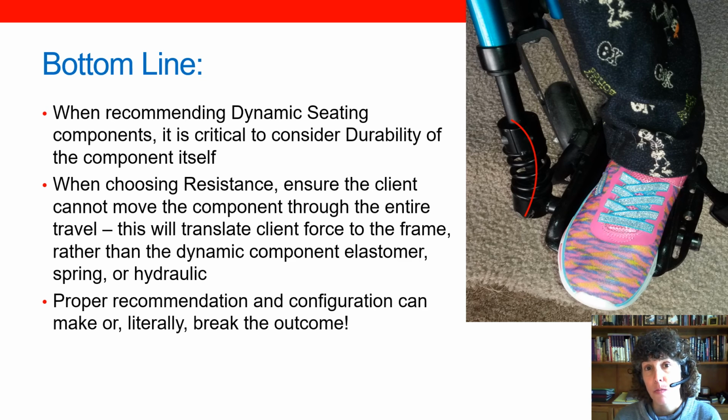Bottom line, when we're recommending a dynamic seating component, it's important to keep in mind the durability of the component itself. When we're choosing resistance, we want to make sure it's not too high or too low, because either scenario could result in some breakage to the frame, as forces will be translated through the dynamic component to the frame itself. Proper recommendation and configuration can literally make or break our outcome for the client.